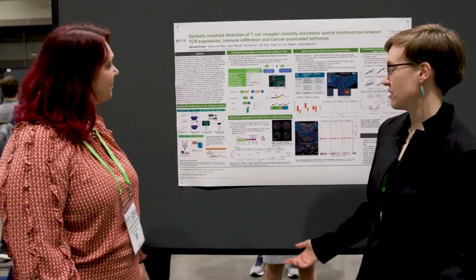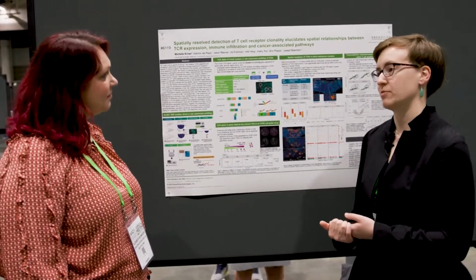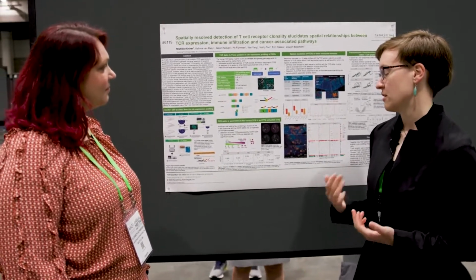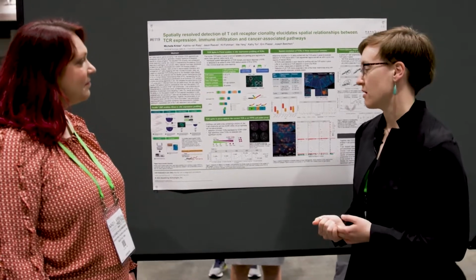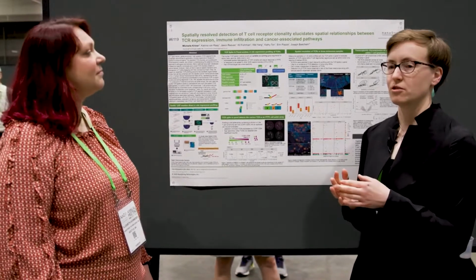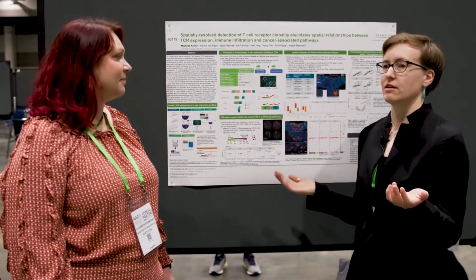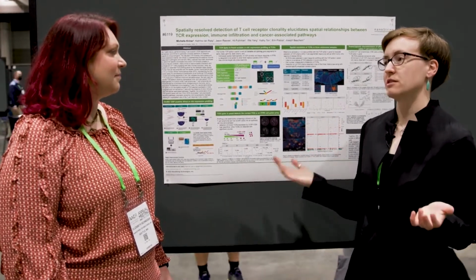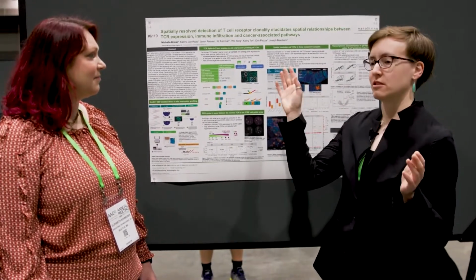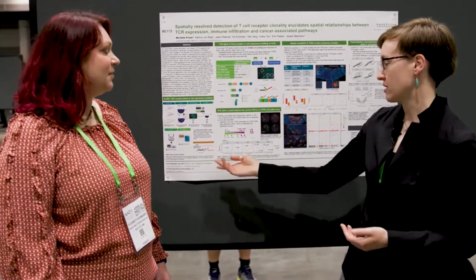Yeah, so actually even before that, the first thing we wanted to do was try to validate that these probes are actually working with sensitivity and specificity that we can be confident in. And so the first thing that we did was test these probes on a cell pellet array where we were titrating in a T cell line into another cell line, and so we know exactly what percent of the sample is T cells, and because it's a T cell line, we know exactly which TCR segments are expressed by that cell line, and so we should see, as the number of T cells goes up, a signal from those expected TCRs going up as well. And so that's what we're showing in this figure.